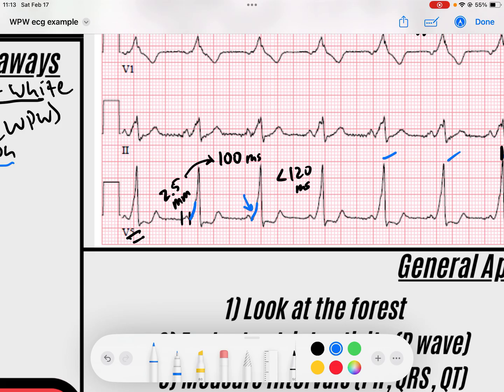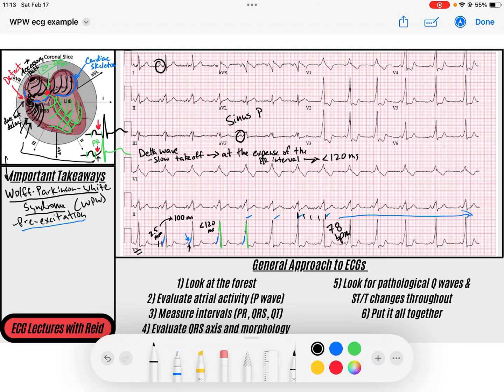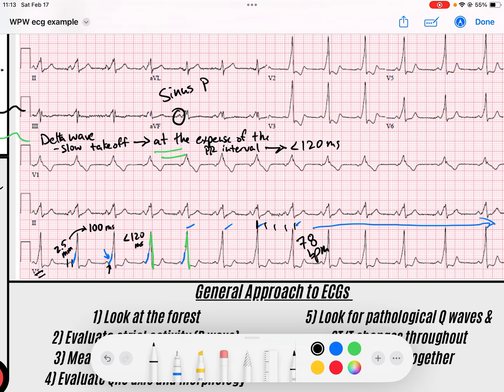Look at these delta waves. These are the delta waves — occurring as that slow slurred upstroke before a nice narrow, sharp QRS finishes it off. These delta waves are what is allowing the PR interval to get shorter. The QRS is widening at the expense of the PR interval, becoming wide because of that slurred delta wave.